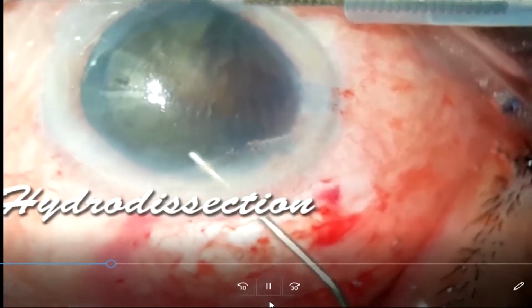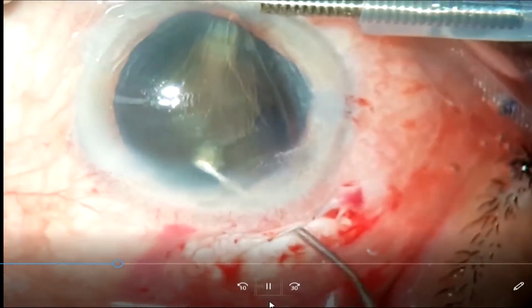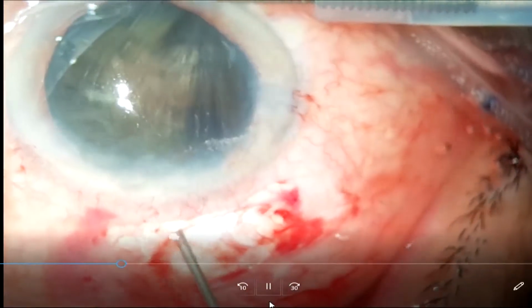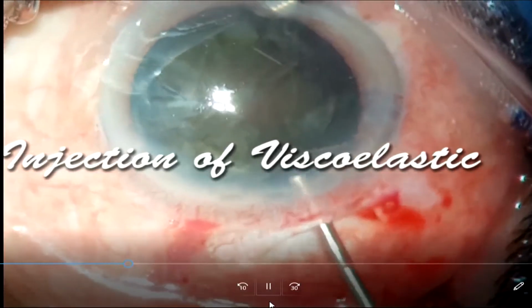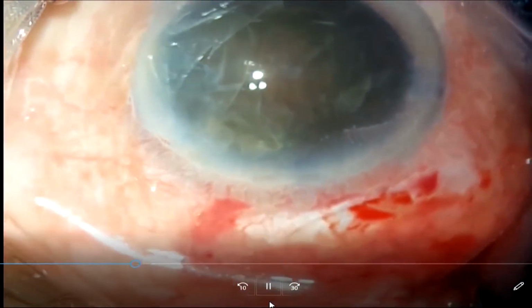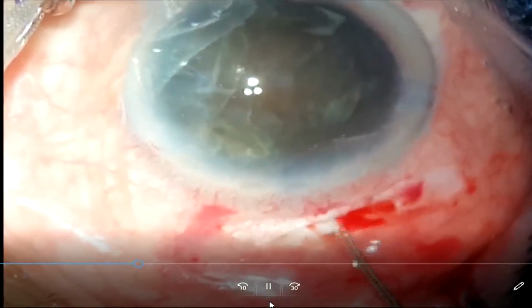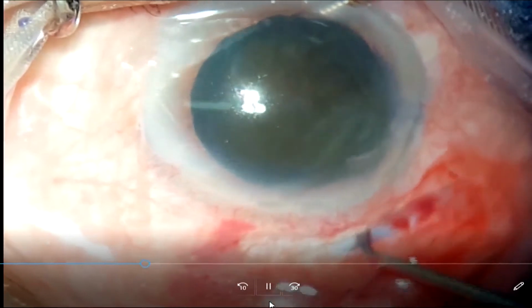After that, a good hydrodissection is done. If your size of the rhexis is corresponding to the size of the nucleus, the moment you try and do your hydrodissection, your nucleus will start popping out. Then remember to inject viscoelastic because this is a hard cataract, you don't want your endothelium to be damaged. So you inject viscoelastic in the front and by the sides.